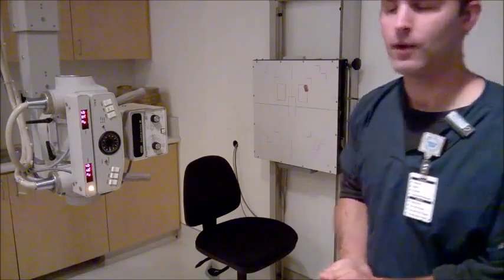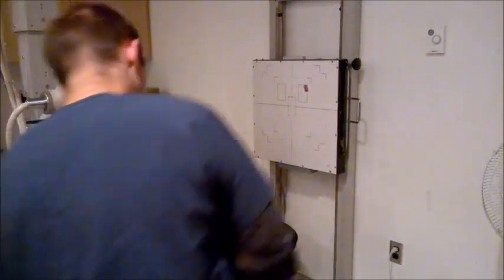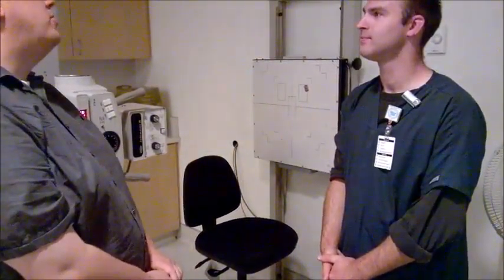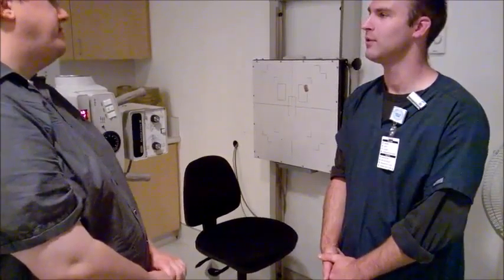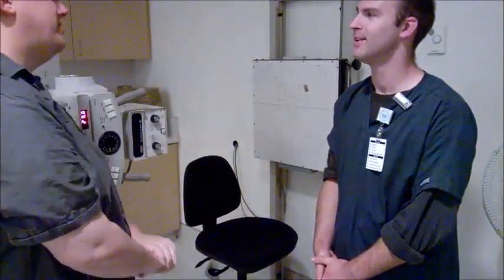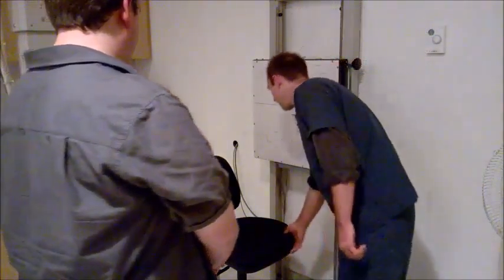All right, I'm going to go get my patient. Mr. Ryan, what's your first and last name and date of birth? Matthew Ryan, 3/20/1986. So what brings you in? What seems to be the problem? I'm just all stuffed up right now. I don't know, my sinuses hurt. Okay. All right, well, we're going to get 4 pictures.